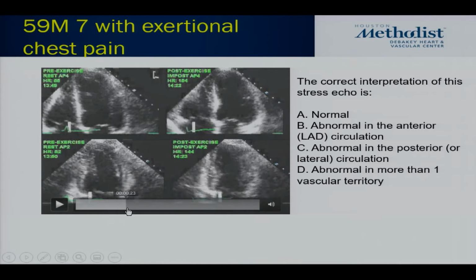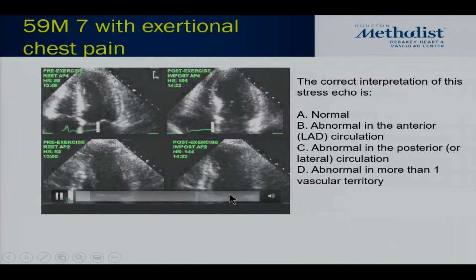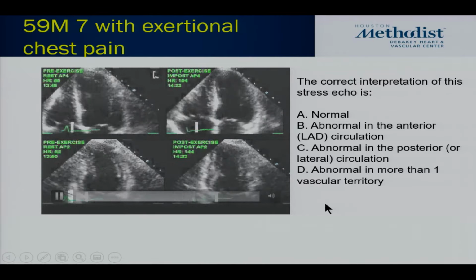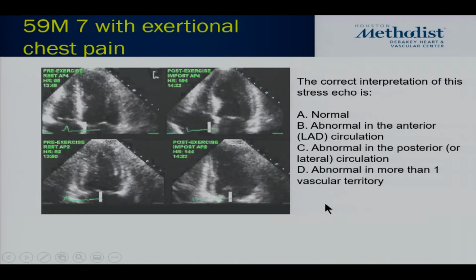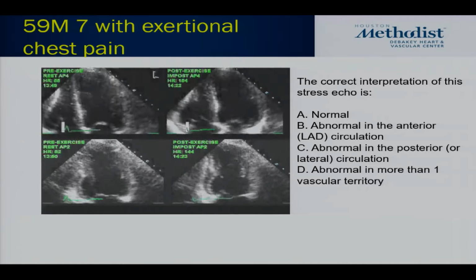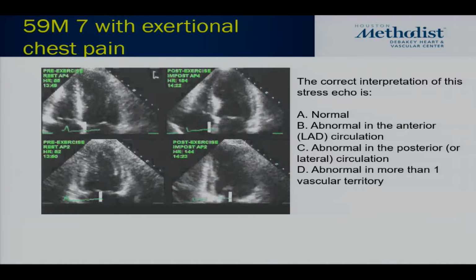I'm not getting it. This is an old clip. Maybe this doesn't have it. But I don't know if you can see it, that you start seeing thickening in diastole. Watch when the mitral valve starts to open. Now. So you actually see that segment thicken very early in diastole, but it didn't thicken in systole.